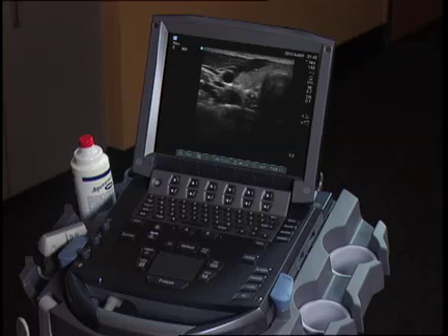Today, I'm going to demonstrate the stellate ganglion block performed under ultrasound guidance. Traditionally, this block was performed blindly without the use of any imaging modality. Currently, fluoroscopy is a preferred method. However, utilizing ultrasound, such as this mTurbo system utilizing the HFL50 linear probe, this can be done with less radiation and avoidance of vascular structures that might not otherwise be seen under fluoroscopic guidance.